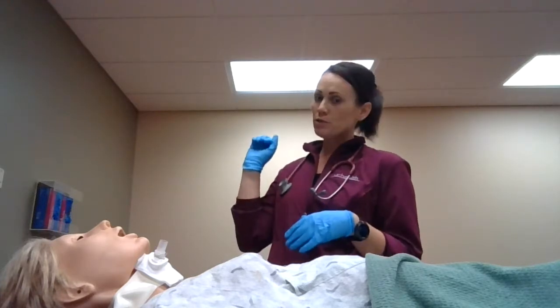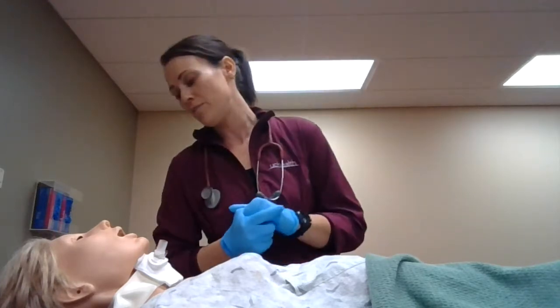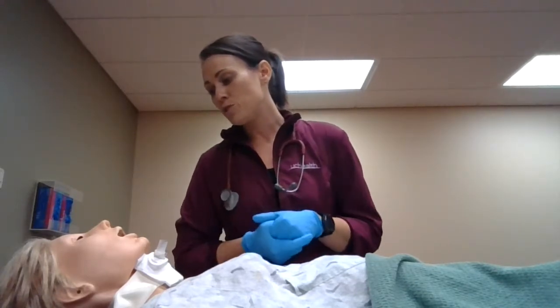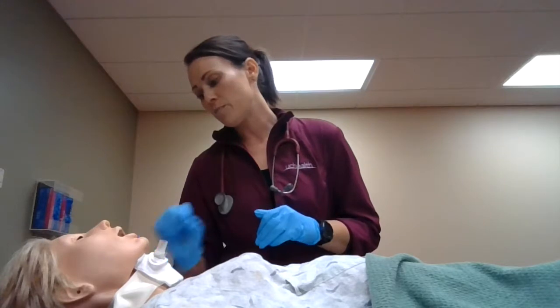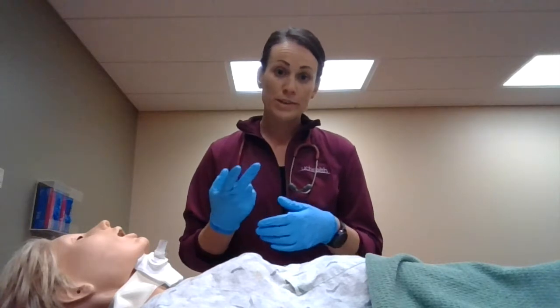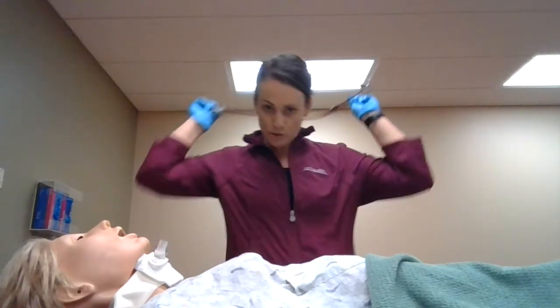I'll go ahead and enter the room. Knock knock. Hi Mrs. Smith, my name is Kate. I'm from the respiratory department here at the hospital. We're going to go ahead and do some trach care and clean your trach site up a little bit. I always want to make sure I communicate with the nurses too — this needs to be done at least twice a day. I'll go ahead and wash my hands, put on some gloves, and do my initial assessment.